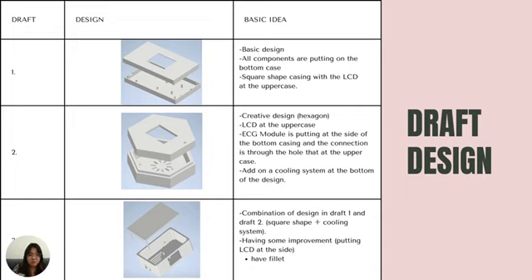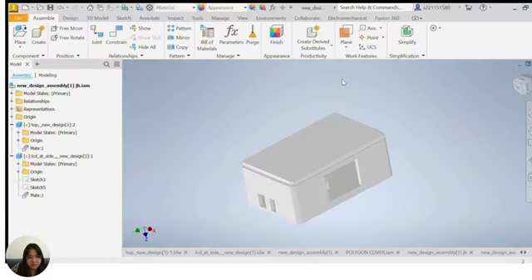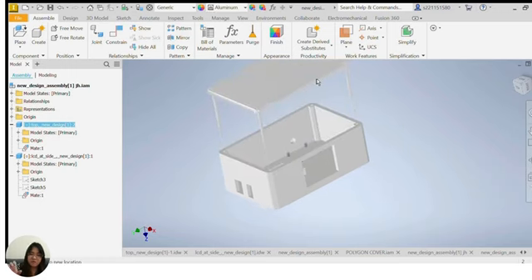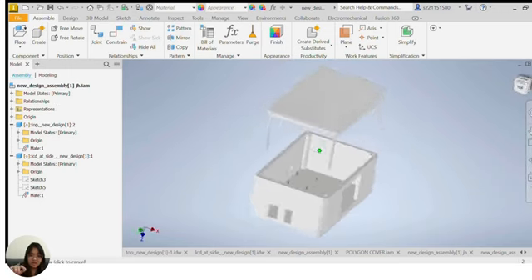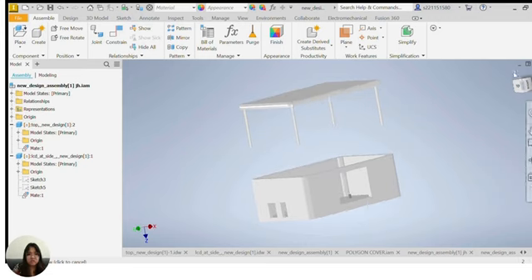It also has some improvement because we put the LCD not on the upper case but on the front surface, for better visibility and protection. And we have filleted it; the fillet functions will be discussed later. Here are the details of draft 3, because after undergoing many tests, our final decision is to use draft 3 as the casing. And here is a video of my design. As you can see, in front there is a hollow place where I placed an LCD inside, and below there is a hole, and the hole is for the ECG module's connection with the outside. So that's all for my part.